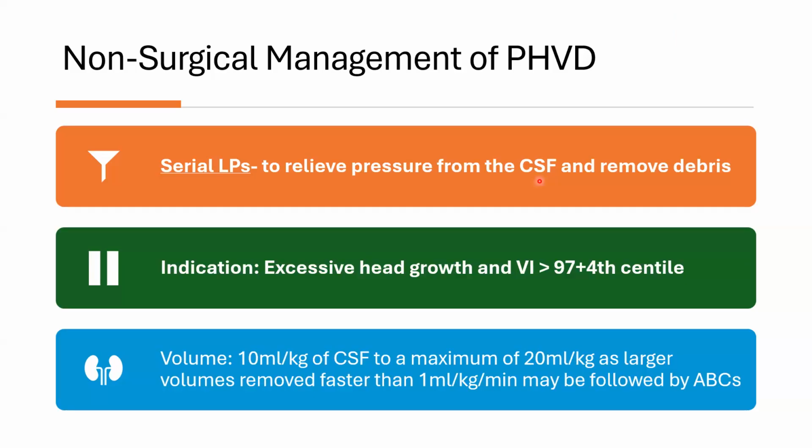Yeah, we used to do serial tapping till the neurosurgeon decides to put an Ommaya reservoir, and after that we just do the scanning to see if we are indicated for tapping or not, pre and post tapping, and to some point it is still the same. We are doing tapping like 3 times per week, so we'll consult again the neurosurgeon, and at that time they will put the shunt if the protein is less than 2.5 gram.